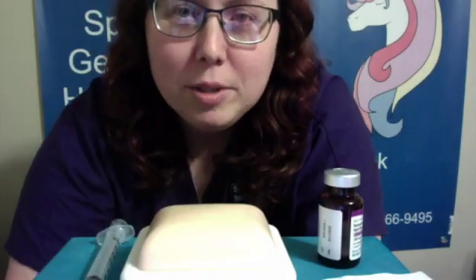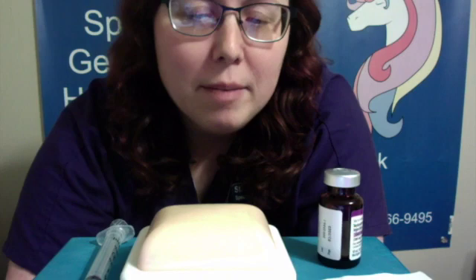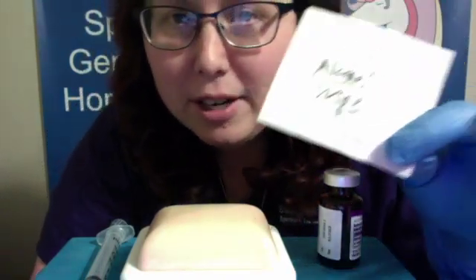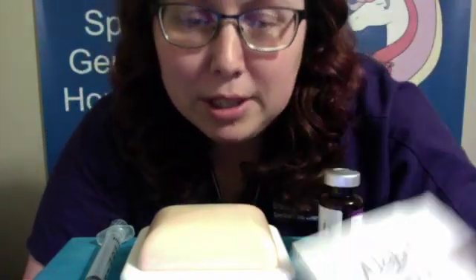Hey everybody! It's Stacey with Spectrum The Other Clinic. Today I'm going to be doing a subcutaneous injection, but a couple of things to note before I get started. I know this isn't an alcohol wipe, but I needed it big so that y'all could see it. I need all my supplies to be big for visualization.